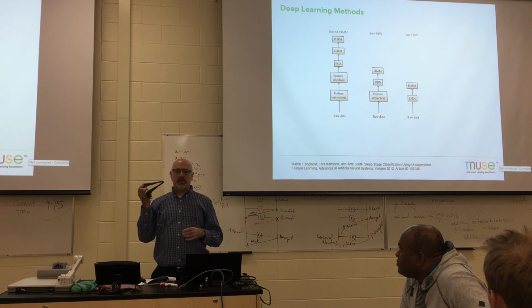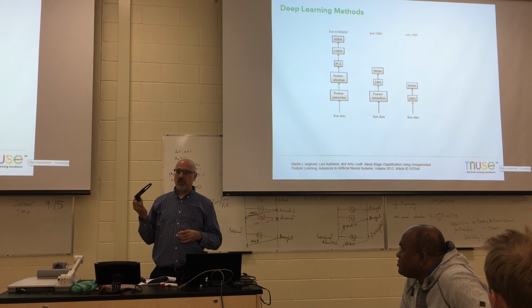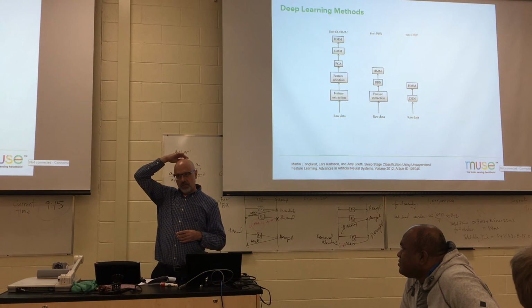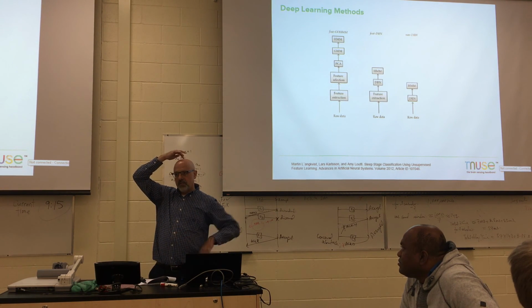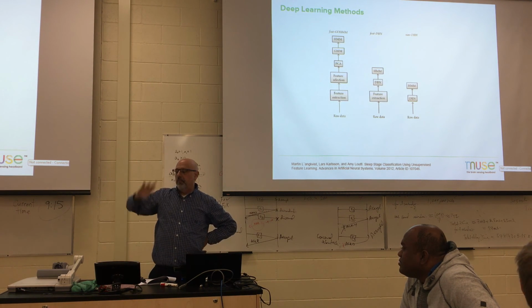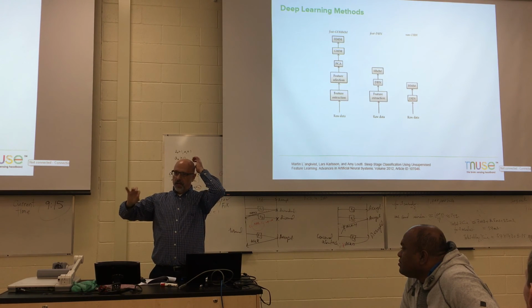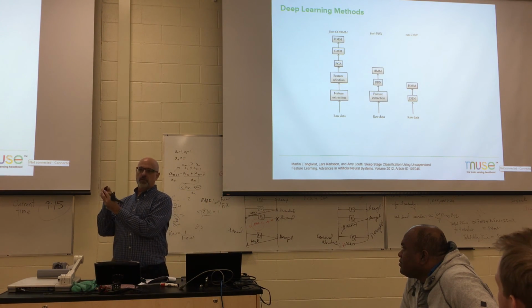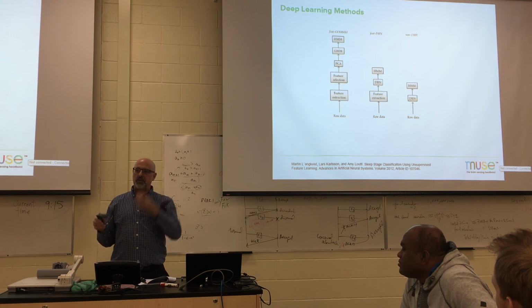Oh, and by the way, if you're looking for projects to do, there is a software development kit that comes for free if you buy the Muse. A lot of students are using Muse for their research or various projects. So if you wanted to get access to CZ, which is the center, or PZ, which is a popular place, you can add an electrode to the micro USB port in the back, with a stick-on electrode, and get access to it.